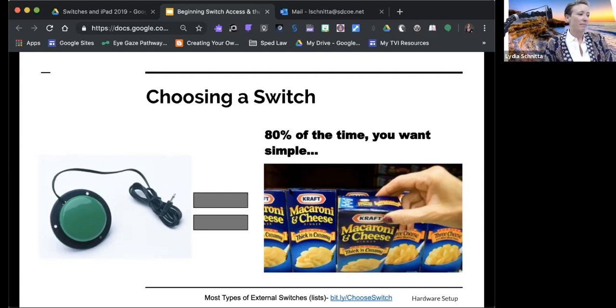And I like the 3-inch size. I've found that with the bigger switches, I have students with a really sensitive touch, and they can actually manage sometimes to press the button and not activate it if they get it right on the edge. So the 3-inch one, if you're not using a hand, it's a little better if you're using an alternative placement, not the hands. If you're using it, you know, at the shoulder or somewhere on the face or the head, sometimes a knee.